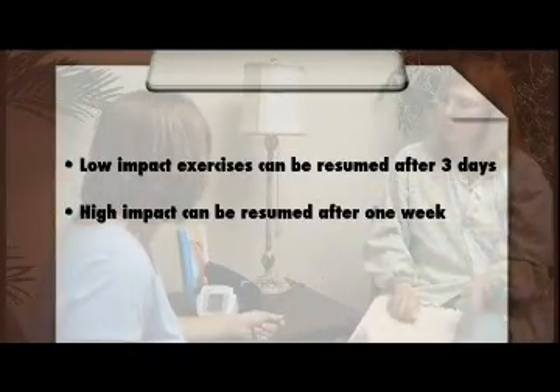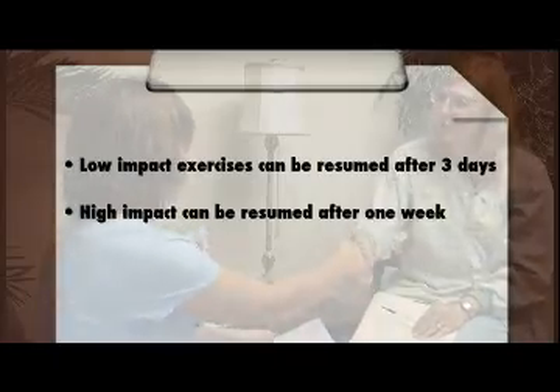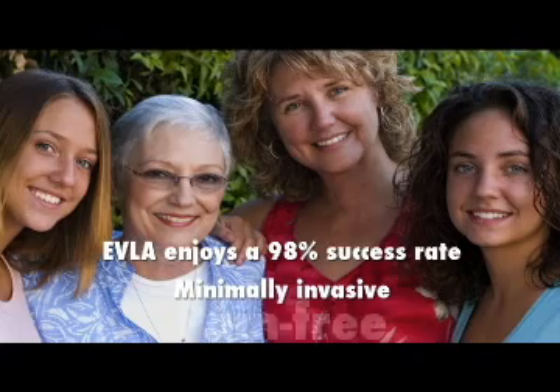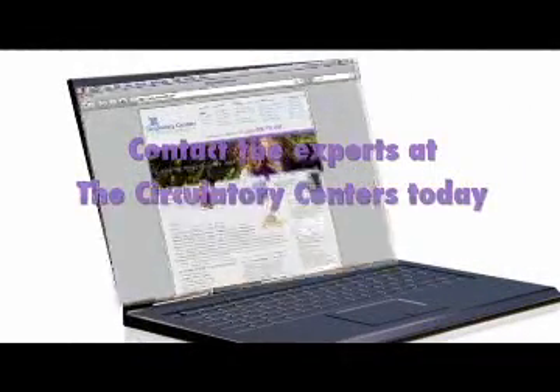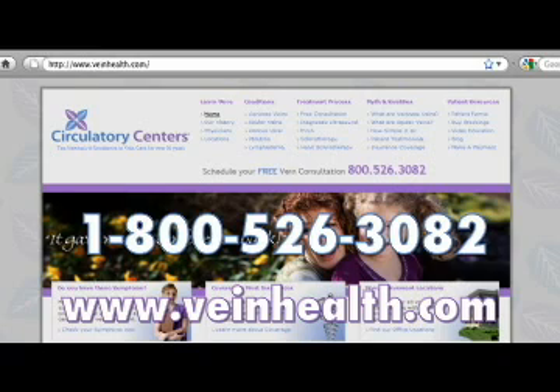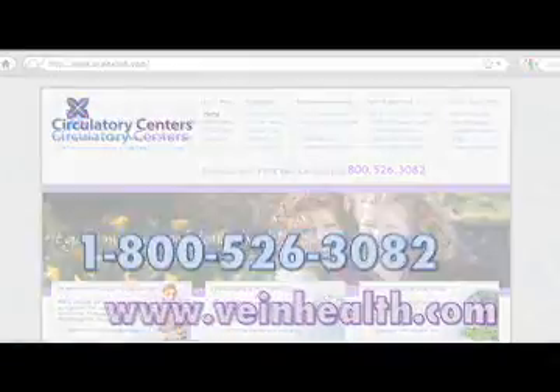EVLA enjoys a 98% success rate, is minimally invasive, and is almost pain-free. Contact the experts at the Circulatory Centers today at 1-800-526-3082, or visit us on the web at www.veinhealth.com. The evaluation is free, and all you have to lose are those unattractive and painful veins.